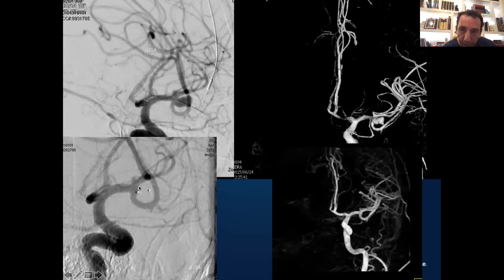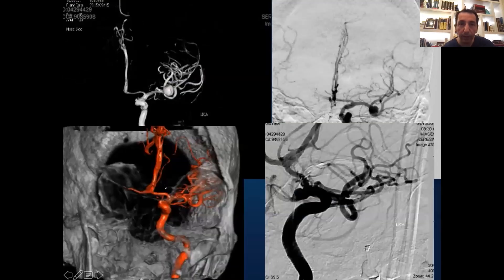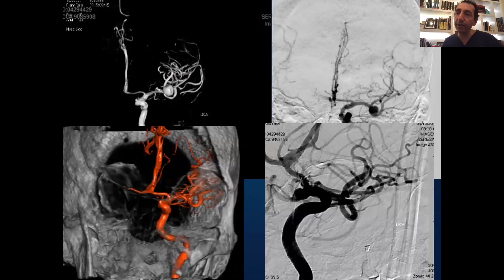Here is an MCA aneurysm before and after. You can see the shadow of the device here on the 3D image. The same thing applies to even large aneurysms — before and after, completely gone. It's a nice device.